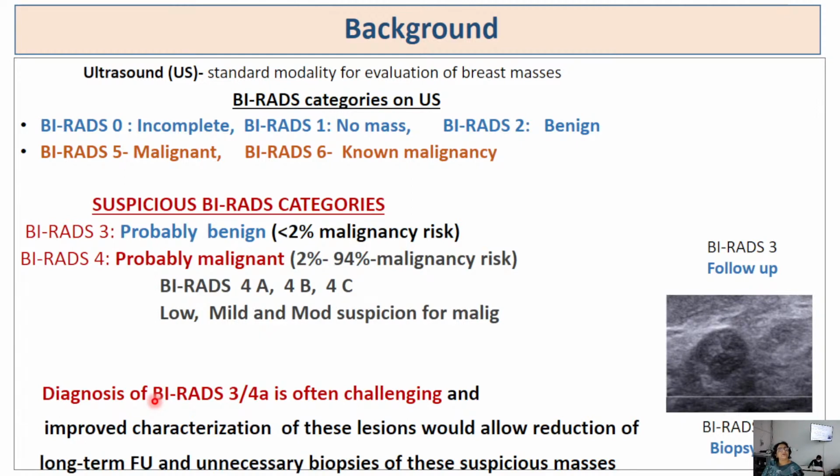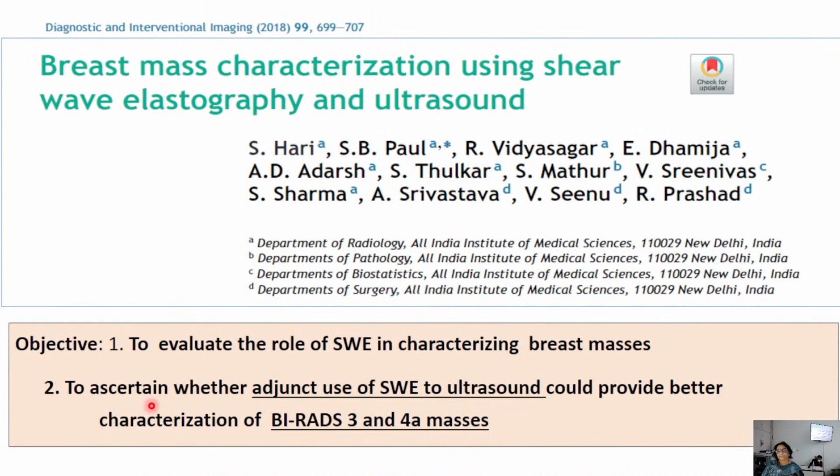And if we are able to focus on improved characterization of these masses, this would help us avoid unnecessary prolonged anxiety of the patient, long follow-ups, and unnecessary biopsies. So this was the study. With this background, we evaluated shear wave elastography for this particular purpose.